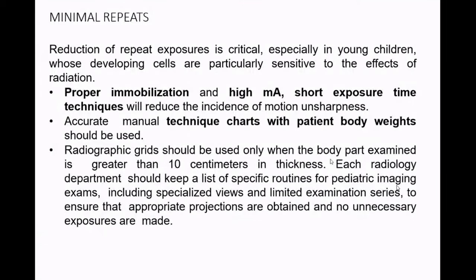So the reduction in repeat exposure is critical, especially in young children whose developing cells are particularly sensitive to radiation. Definitely this is the major point, because the cells and bones are in the growing stage. If you are giving an extra radiation dose, definitely it will cause harm to the patient.